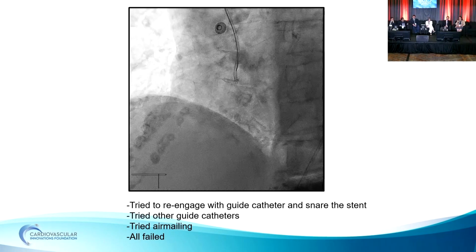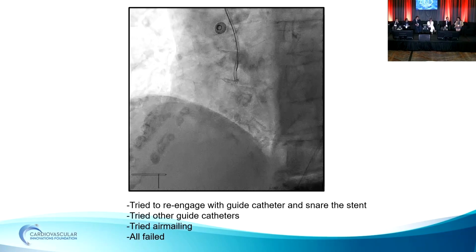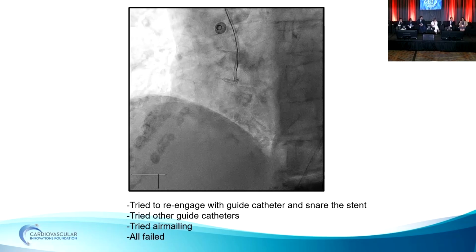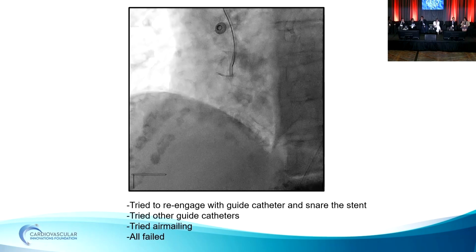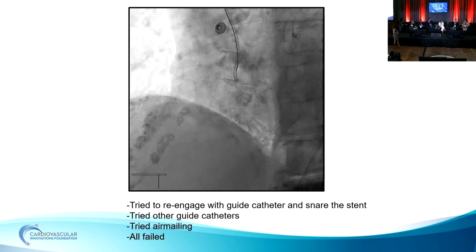I will share, when I started at my position 3 years ago, I had never really used a wiggle wire. And there's a famous quote, one of my partners is laughing in the audience. I said, wiggle wires are for old people. And I have lived that down and regret those words very much, because I think in the case where I'm fighting a guide, getting a supportive wire that's really going to help hold things in can help kind of avoid this situation.